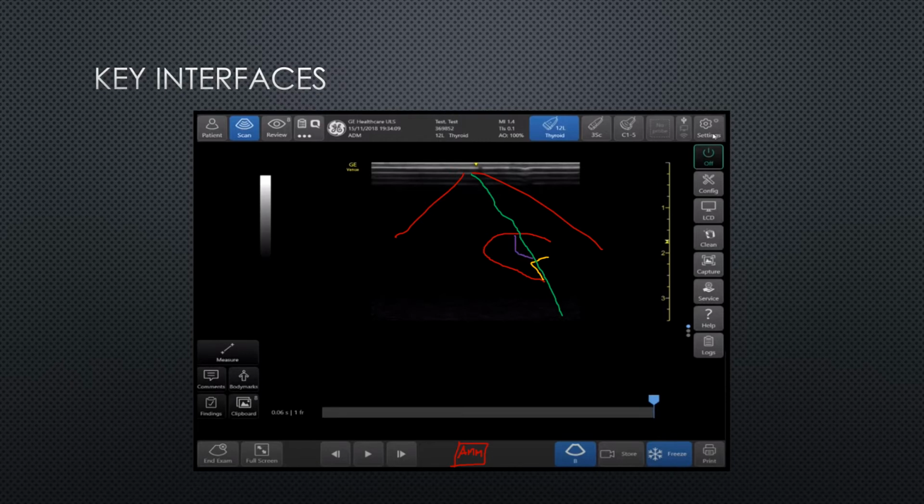Whereas if you use anatomic M mode, you can set a gate here and say, this is the structure I'm looking at, and this is the direction I want to do it from, and you can get your M mode this way, which you can see would be much shorter and actually more accurate. So this is something that I think GE does well, and it's available on our machines, and you should certainly use it and learn to use it, because I use it all the time and love it.